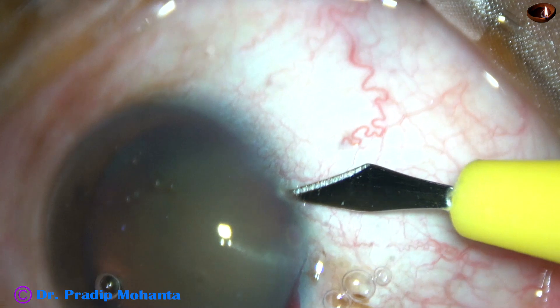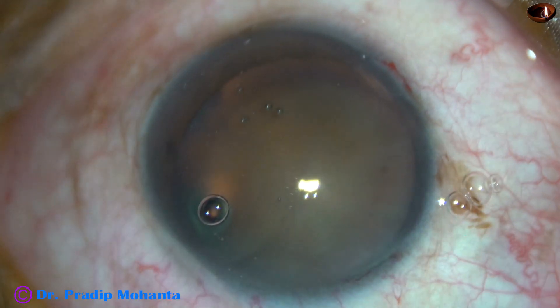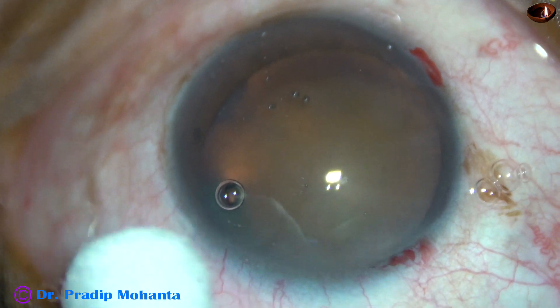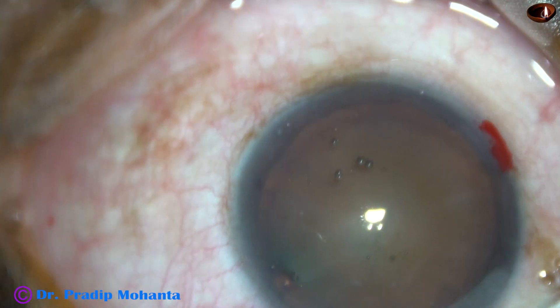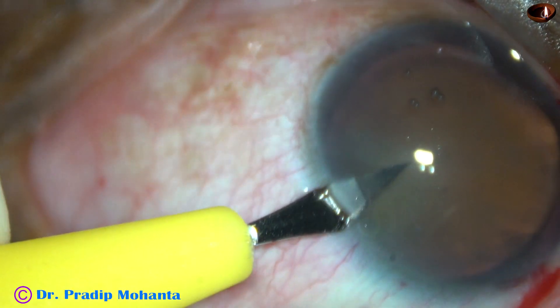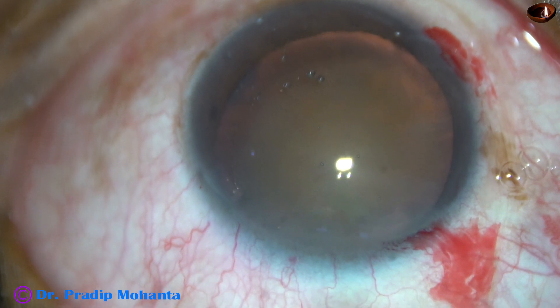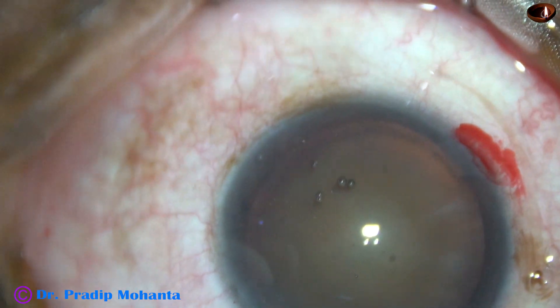Two side ports are being made in this case. This is the side port on the right side, and this is another side port on the left side of the main incision. The side ports are about 3 clock hours away from the main incision.